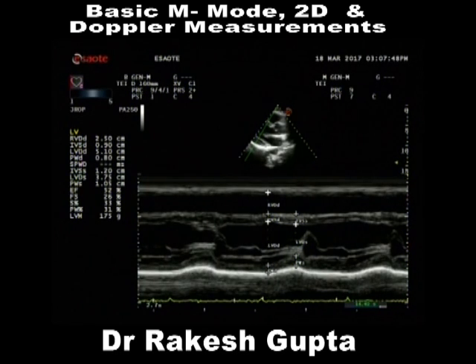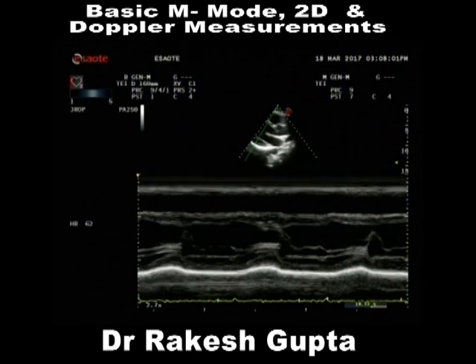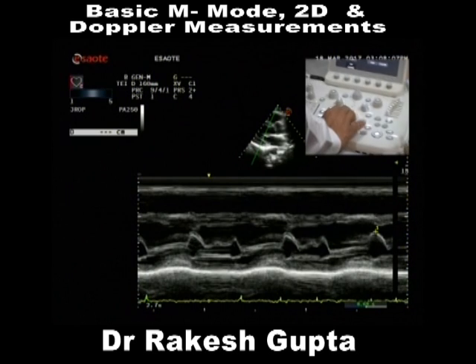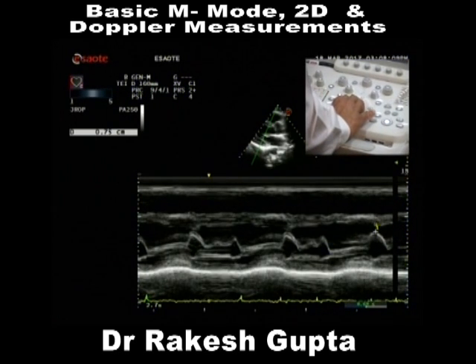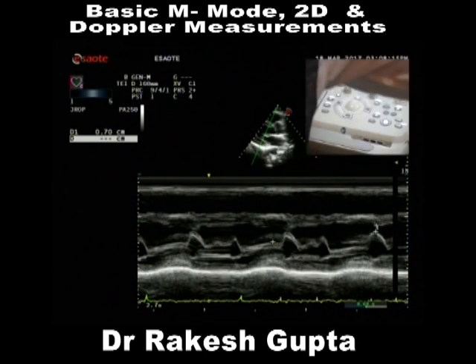Because this is what we all expect from you. There is one more point left apart from this, and it has a lot of values. This is a point known as E point septal separation, and normal is 5 to 7 millimeters.